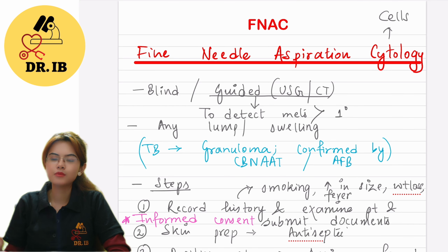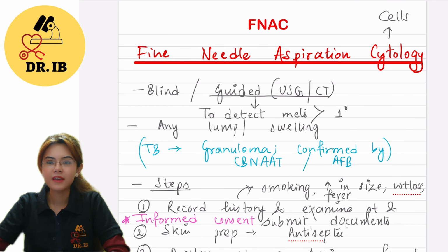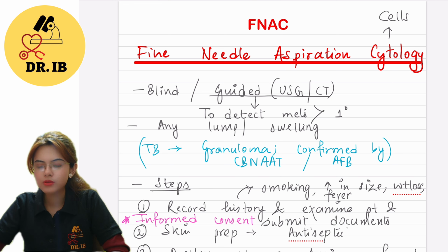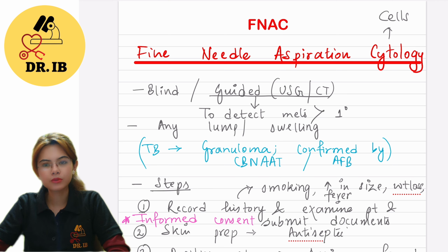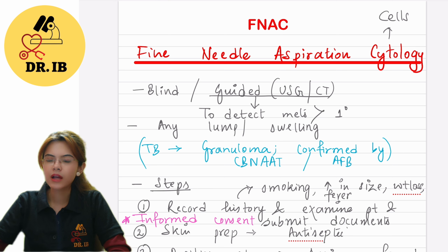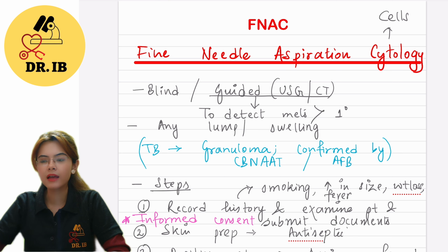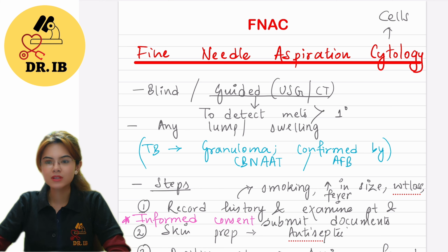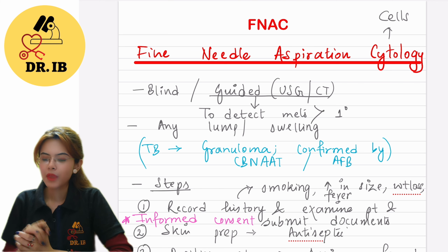Hello everyone and welcome to this new video on FNAC or Fine Needle Aspiration Cytology. Through this video I will explain all the process, all the important points that people tend to miss out, so that you can perform a successful FNAC. I will also show you a video demonstration. So this video will be interesting. So let's get started.